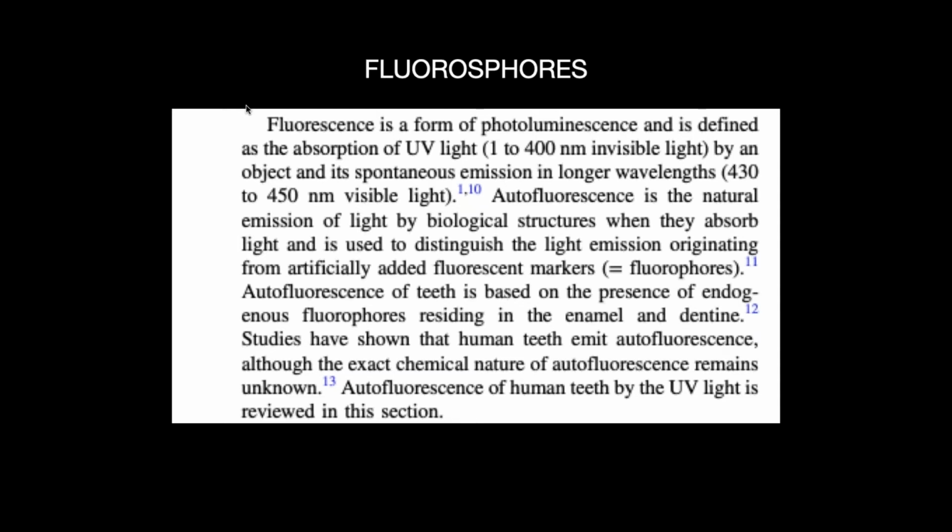But the idea is that these fluorophores allow the teeth to become beautiful and bright and alive when you go outside or change light sources, where the teeth that don't have it, they just don't look right. And this is a problem with some of the early lithium disilicates, etc., that don't have any fluorescence whatsoever. And they're always going, quote unquote, gray looking in the mouth. And that could be a combination of factors, but one is that they don't have any material that can be put in there to make it fluoresce.